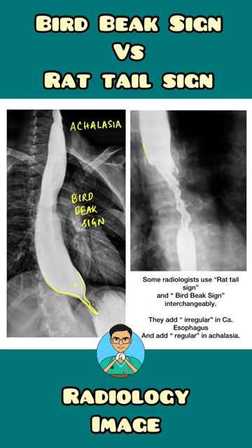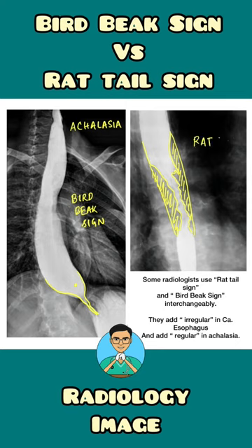On the right hand side image, you can see that the esophagus has got narrowed down in the barium swallow, but this narrowing is very much irregular. This irregular margin of the narrowing represents that there is presence of some mass in the esophagus which has caused this narrowing to occur, and this sign is known as the rat tail sign, seen in case of cancer esophagus.